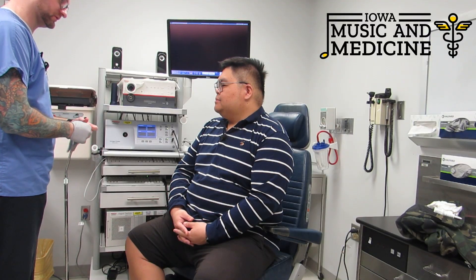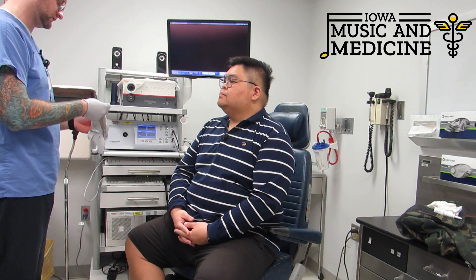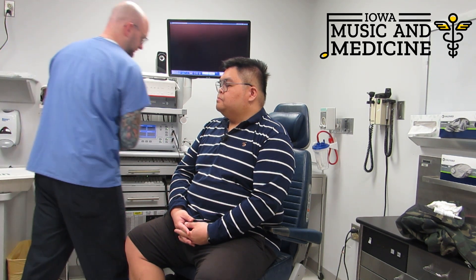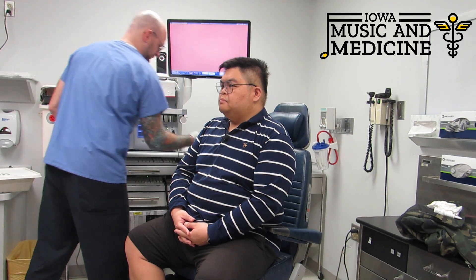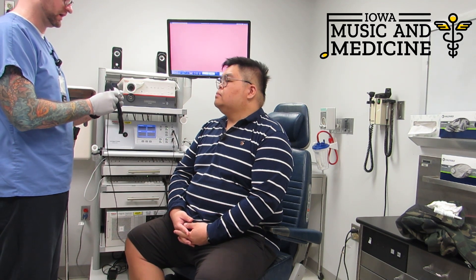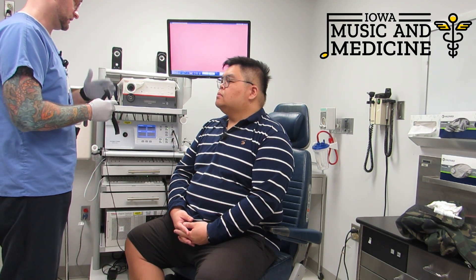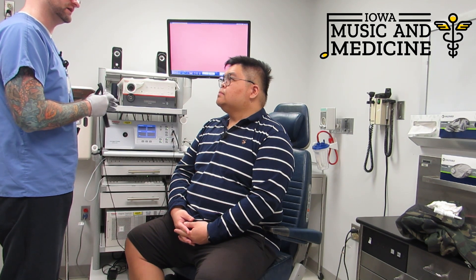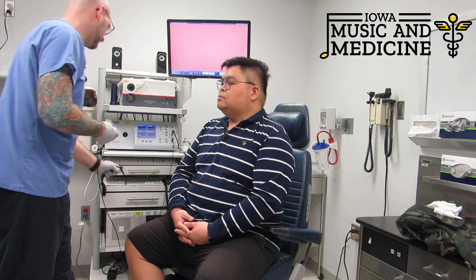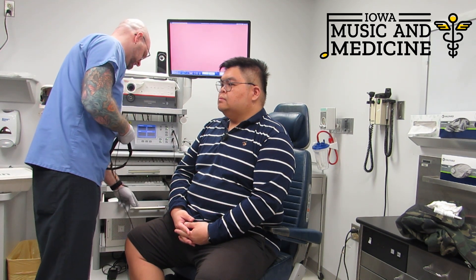First I'm going to give you a couple different microphones. One is going to sit over top of your ears so that way we have an audio signal for the video itself. And then the other microphone is going to sit on the side of your neck and will pick up vocal sound around the side. This microphone is going to measure how fast your vocal folds are vibrating and then it'll coordinate our flashing lights such that it will set up a slow motion picture of your vocal fold vibration, so that way we can see how they are moving while you are doing different vocal and singing tasks.